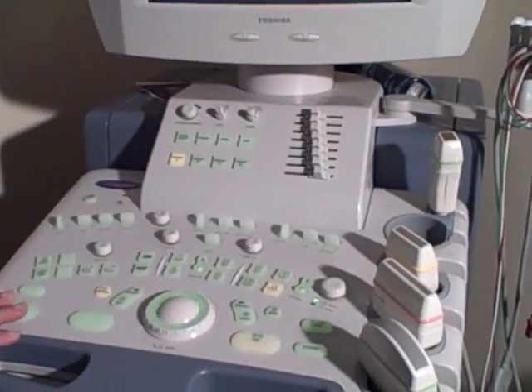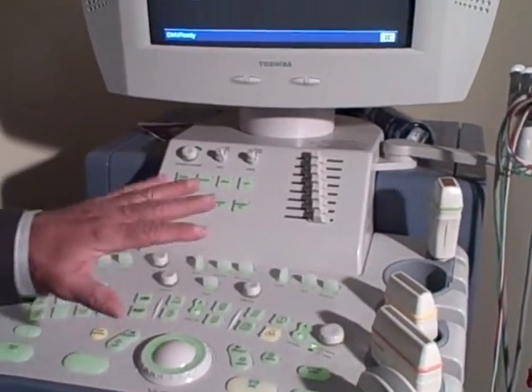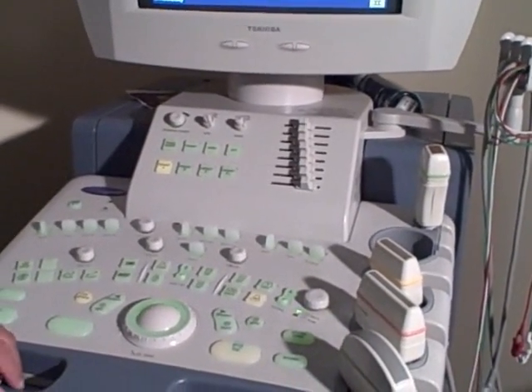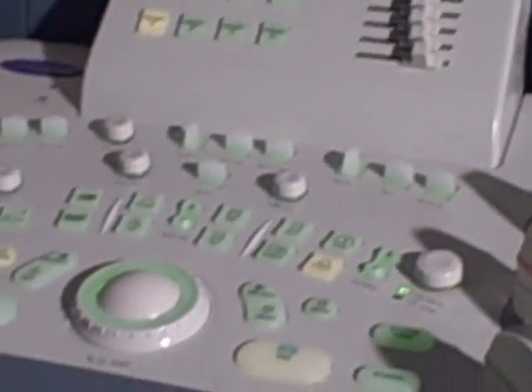This is the board of the machine. There are some buttons here that we need to know how to use, but you don't need to know how to use all the buttons to make a protocol. There are only some important buttons, like 10 or 12 buttons.